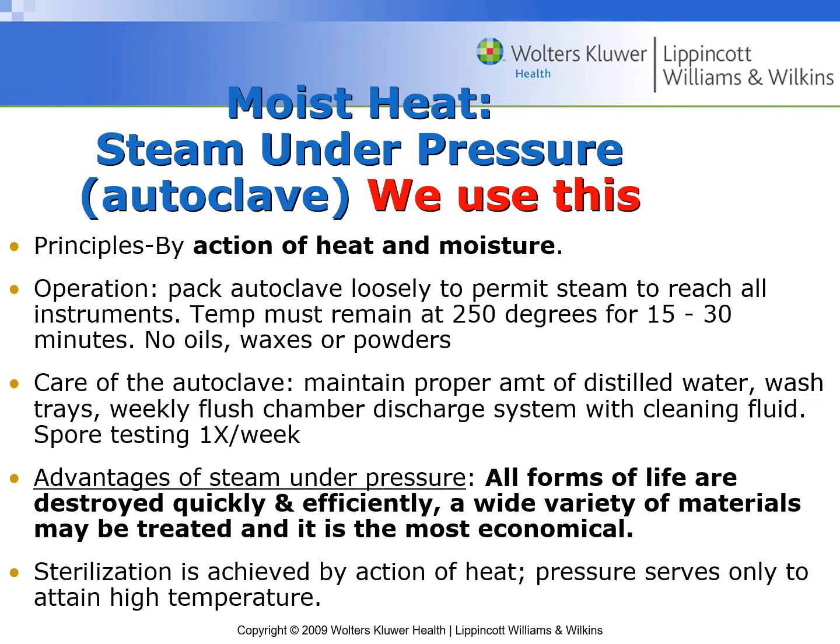Now, moist heat is what ours is at the clinic, and this is what most of the offices I ever worked in had: steam under pressure, which is moist heat. It's called an autoclave, and it works by the action of heat and moisture. So we pack the autoclave very loosely to permit steam to reach all of the instruments. We don't, which a lot of offices do, keep piling things on top of each other. We want a level playing field there so that the steam can get into the individual packages. The temperature must remain at 250 degrees for 15 to 30 minutes. Ours is 30 minutes. We don't put oils or waxes or powders in there at all. And those mainly come from items that the dentist would use, not that we would use.